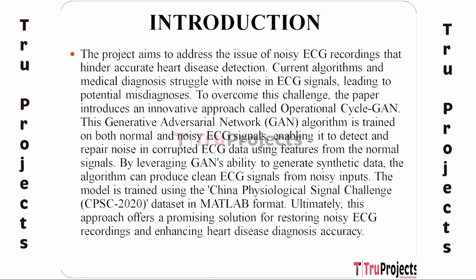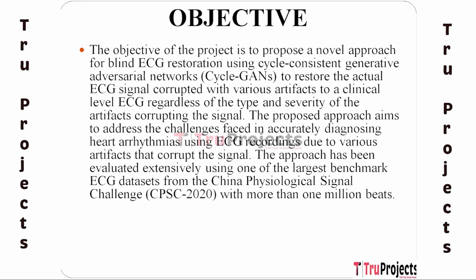The suggested method was thoroughly tested utilizing one of the largest benchmark ECG datasets from the China Physiological Signal Challenge CPSC 2020, which contained over 1 million beats.